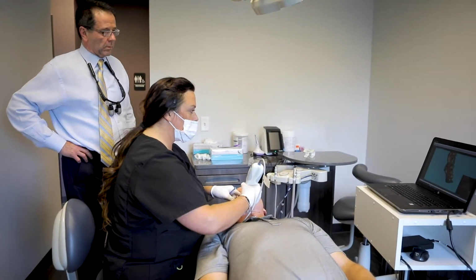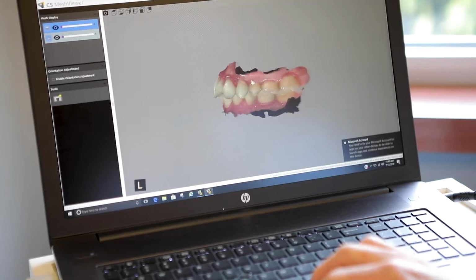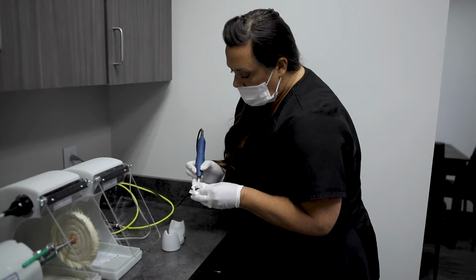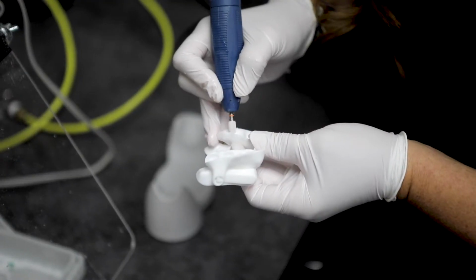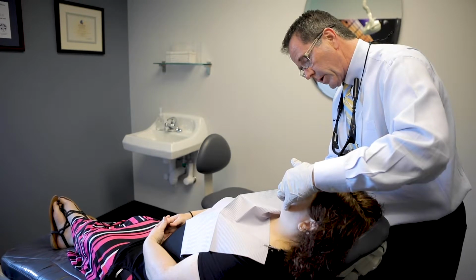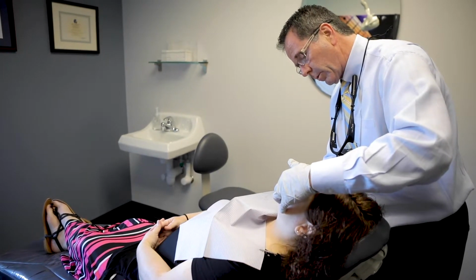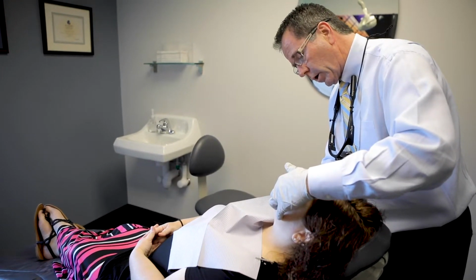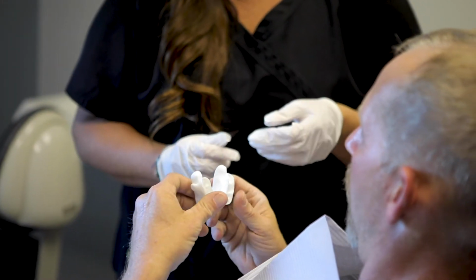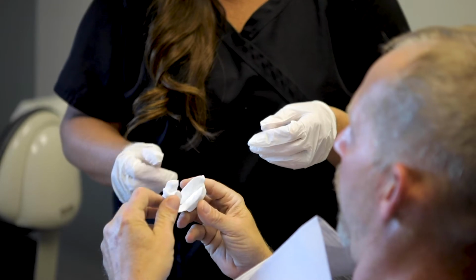We use a scanner to get a detailed fit of their mouth. And these devices are able to be customized to get the person breathing better. So these are long-term solutions to get someone to be able to breathe better that are very easy. You just, right before you turn the light out to go to bed, you pop them in your mouth, you go to sleep. And in the morning, you take it out, rinse it off, and put it in a container and go to work.